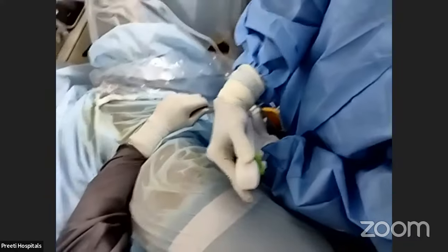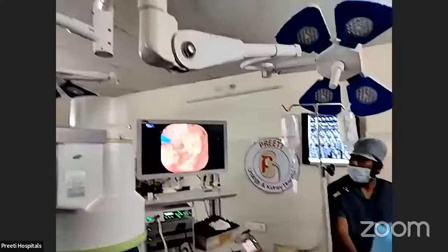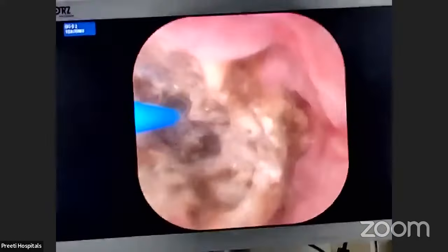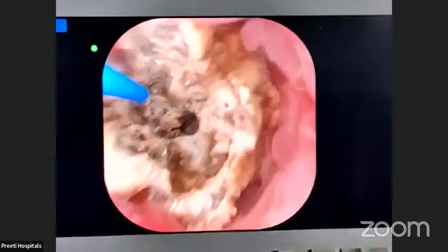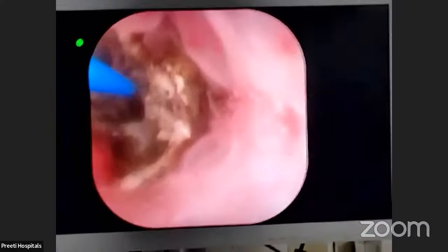Up to the tip of the stone, up to the tip of the calyx, up to the tip of the inferior calyx, everything matters. See, don't suck now. For 5 seconds, don't suck. How the powder will accumulate, I will show. Don't suck. Now, this is the powder. See, it's not even seen. Automatically, it's coming out. Now, you suck. How beautiful it will be. See, stone vision will be better.